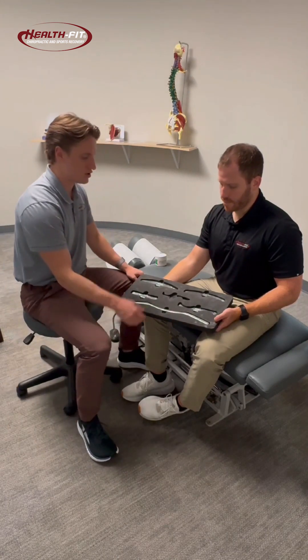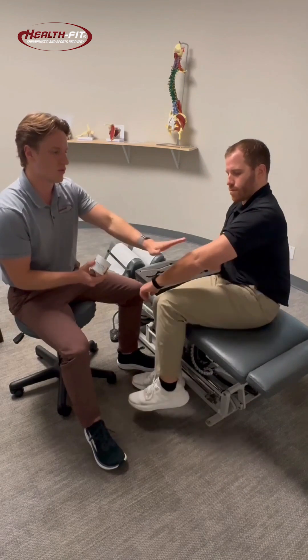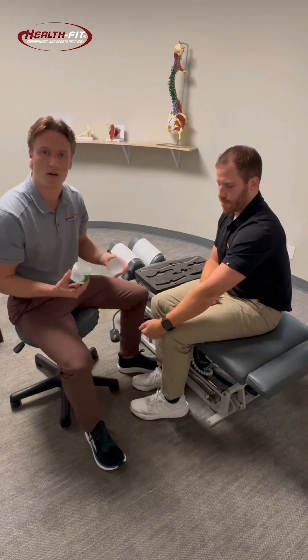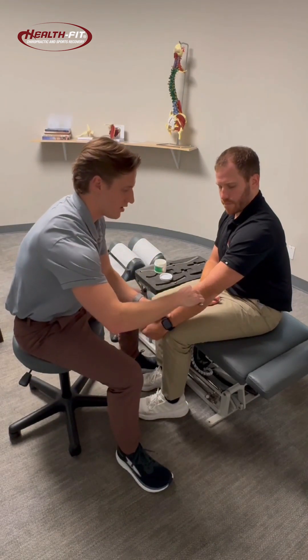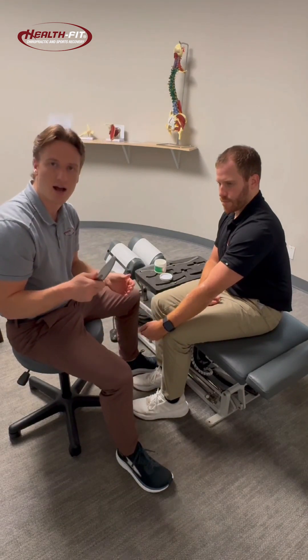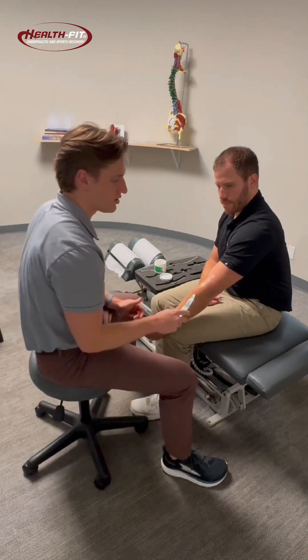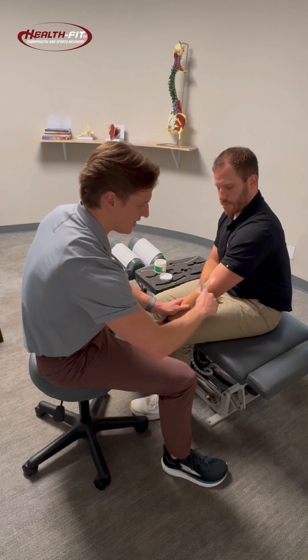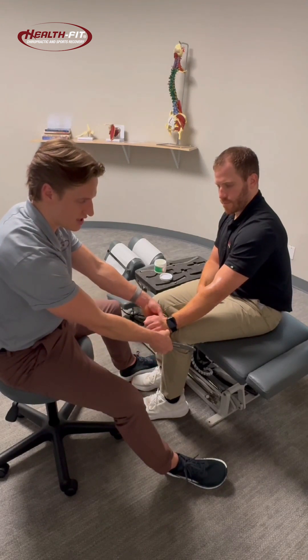The main thing with scraping is we have an emollient that we use as a barrier on the skin. We're going to pretend that Matthew, our intern, has lateral epicondylitis — often known as tennis elbow. We'll take a little bit of this emollient gel and cover the skin in the area, which really allows the beveled edge of the tool to slide through better. Once it's spread around, we'll start with nice small strokes working our way down the tendon, targeting what's called the forearm extensors, which allow Matthew to extend his wrist like this.